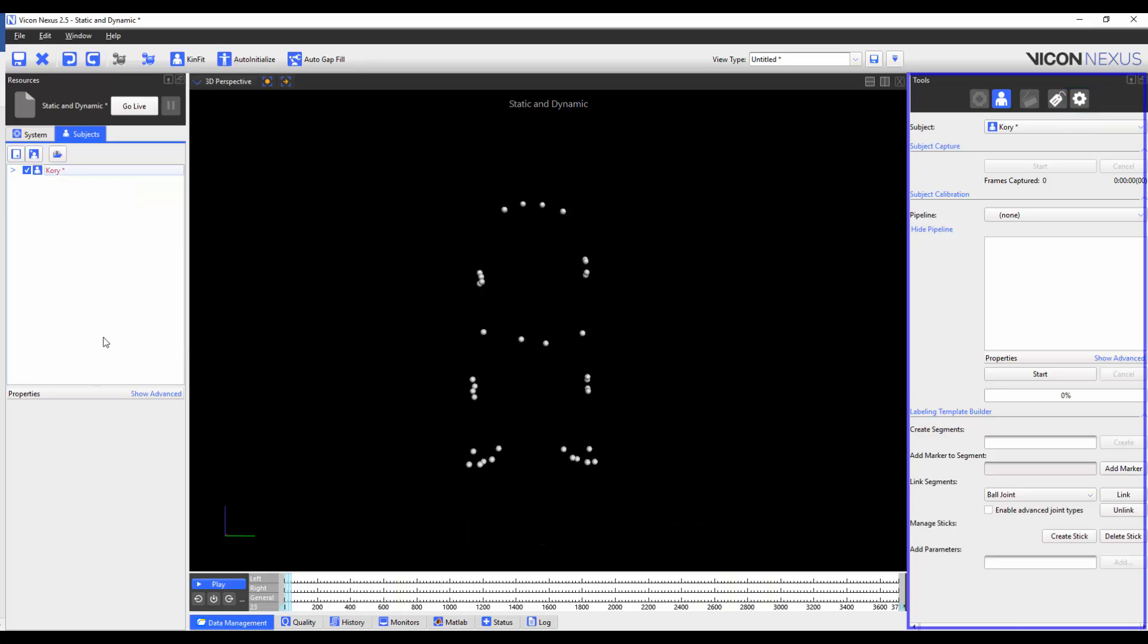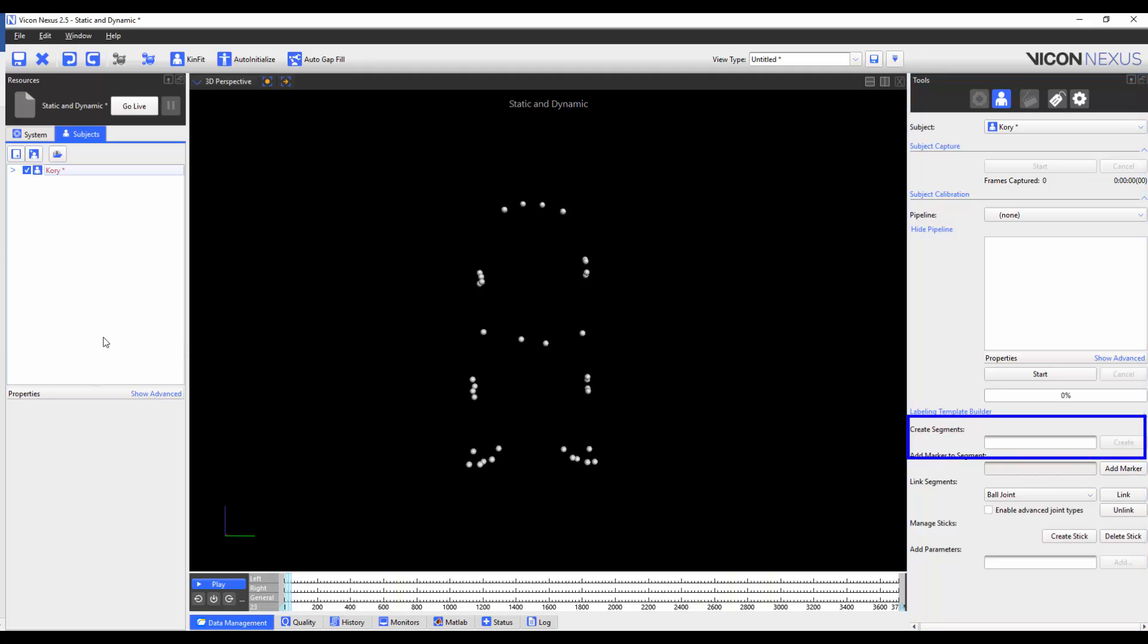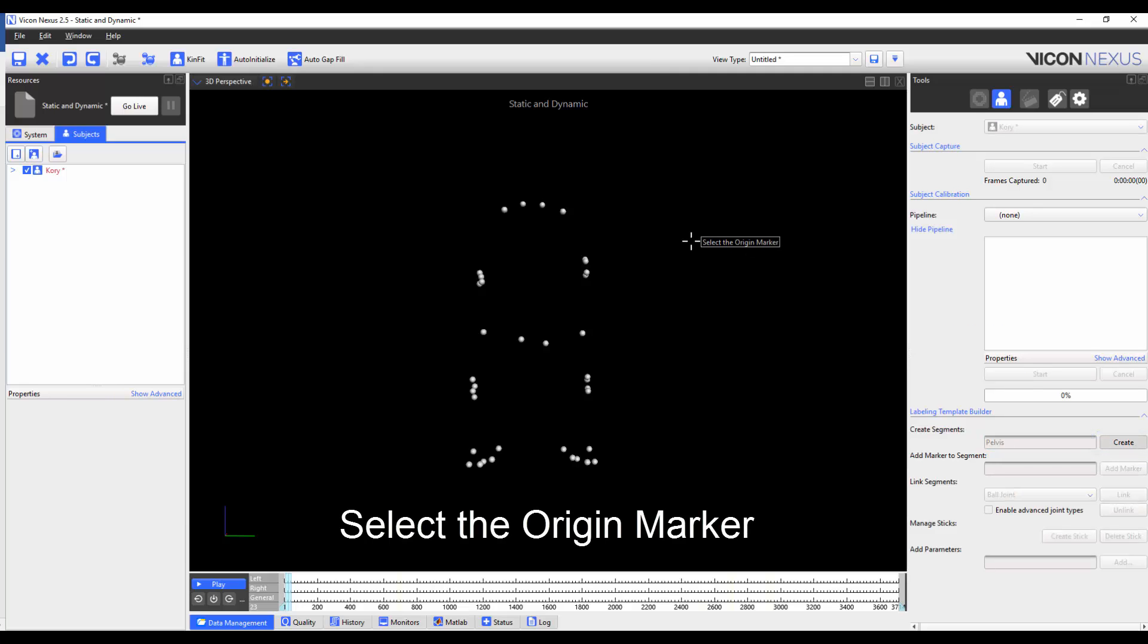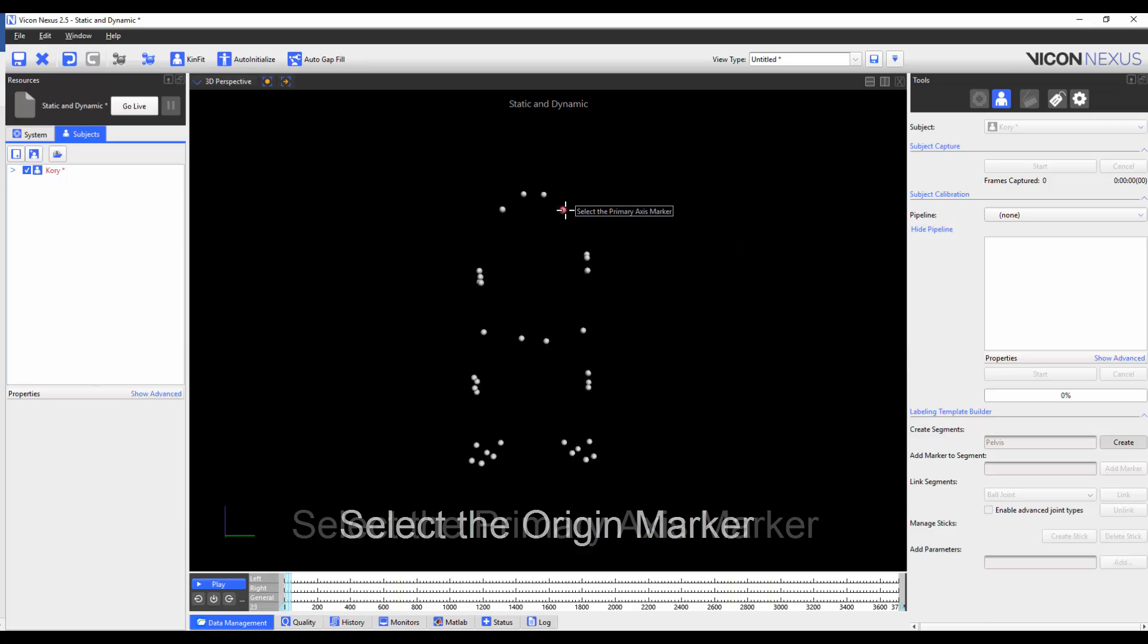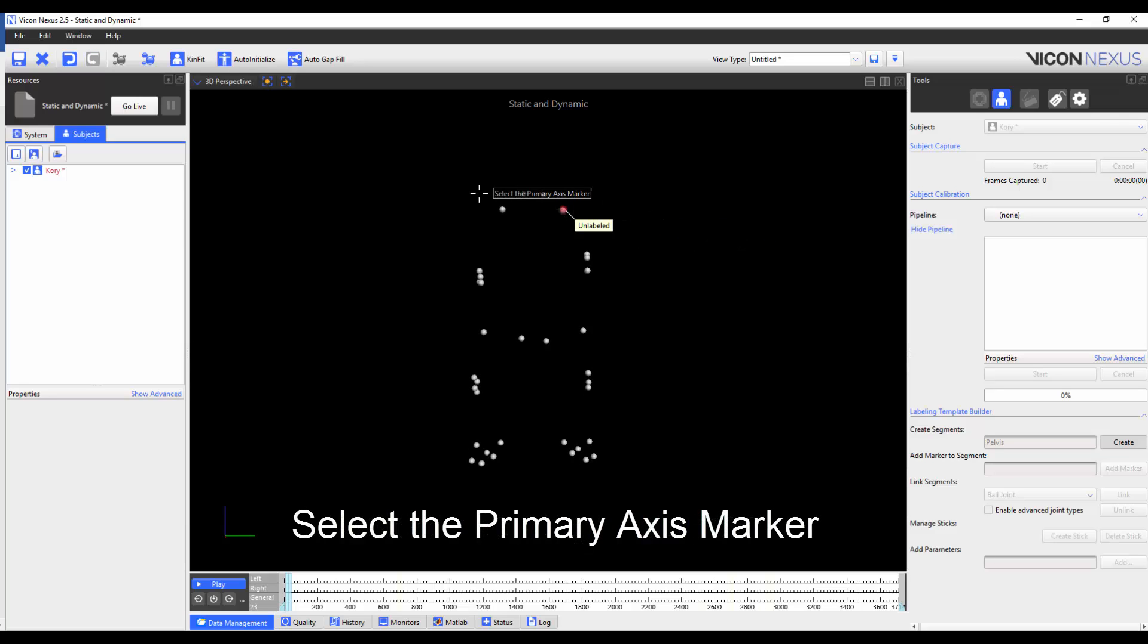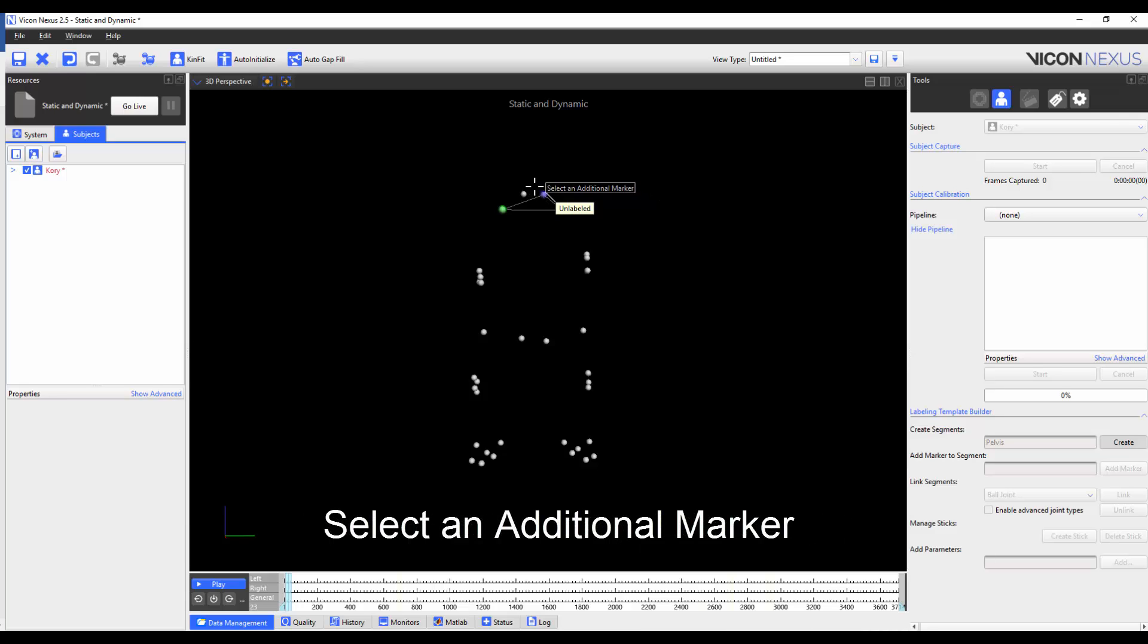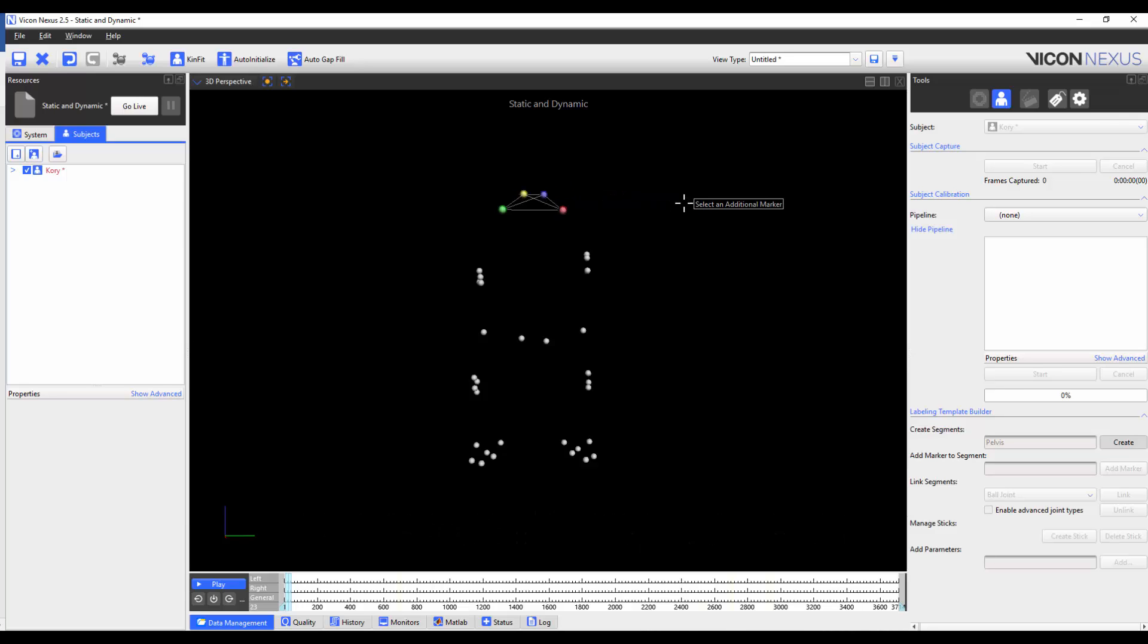To create a segment, we need to go to the Tools pane, Subject Prep tab and write a segment name. In this case, I'm going to create the pelvis segment first. After I type the title and press Create, it will prompt me to select the origin marker, then the primary axis marker, the secondary axis marker and more additional markers. When I've chosen all four, I'm going to press Create again.